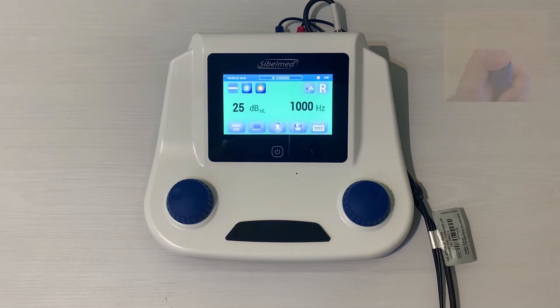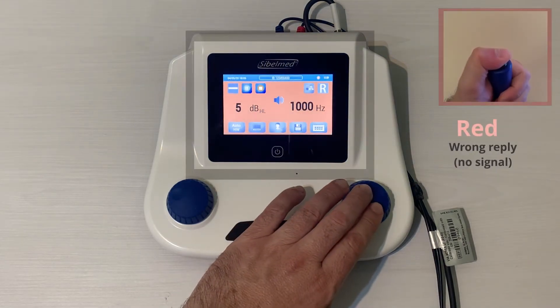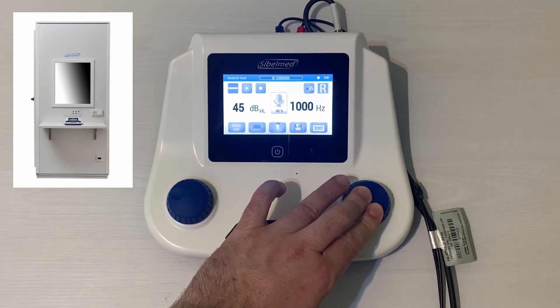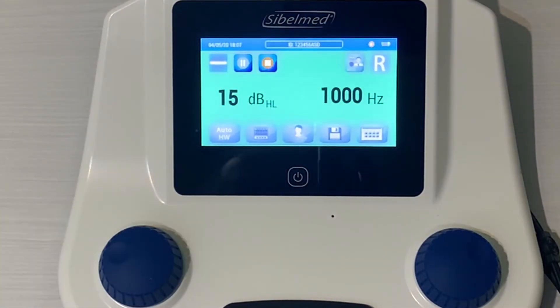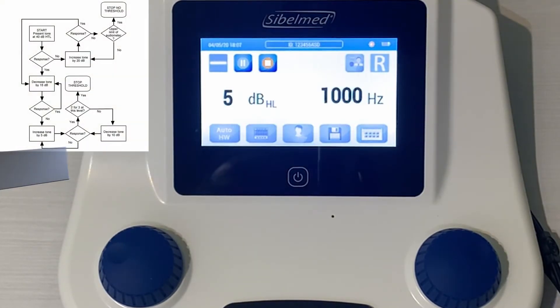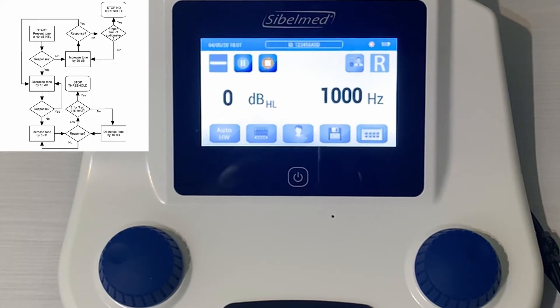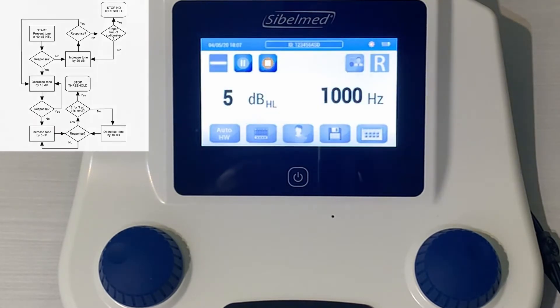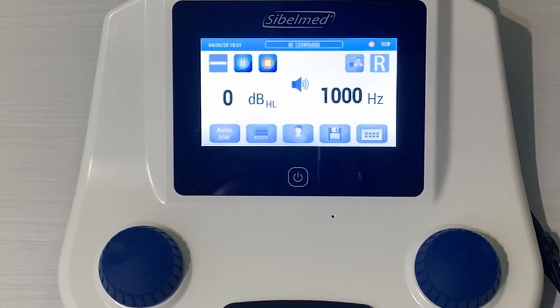If we need to talk with the patient during the test, especially when using a booth, we can enable the intercom option by pressing the right controller. This will pause the test. After the familiarization process, press the play icon to start the automatic test. The unit will issue different tones at different frequencies, following a process similar to the air conduction tonal test. It will start by issuing a 1000 Hz tone with an intensity 10 dB above the one identified during the familiarization stage, or with the intensity set as the starting level on the automatic test configuration screen.